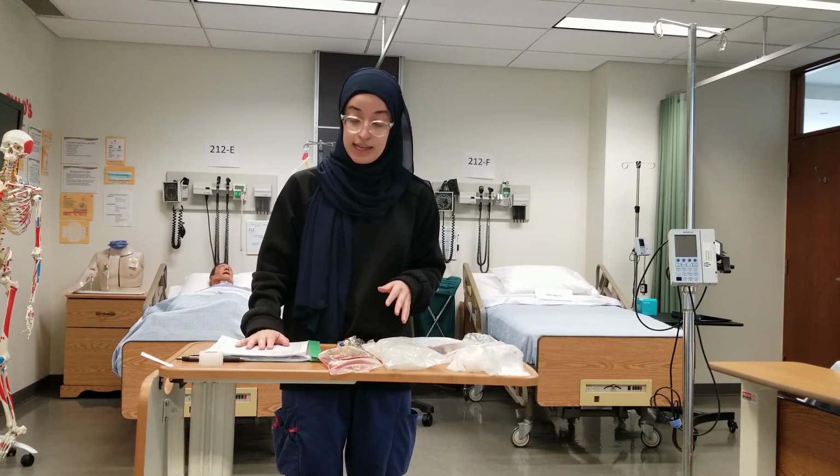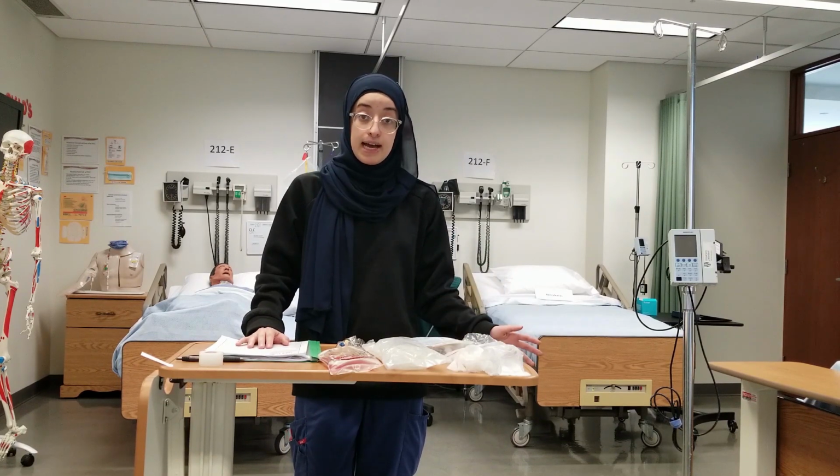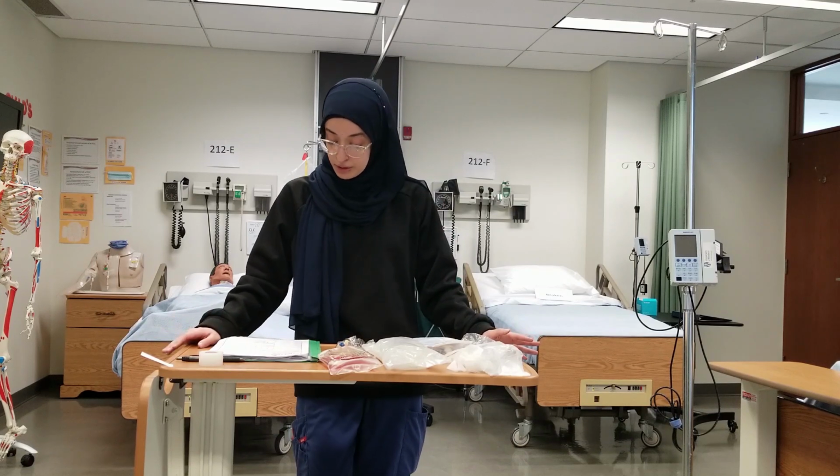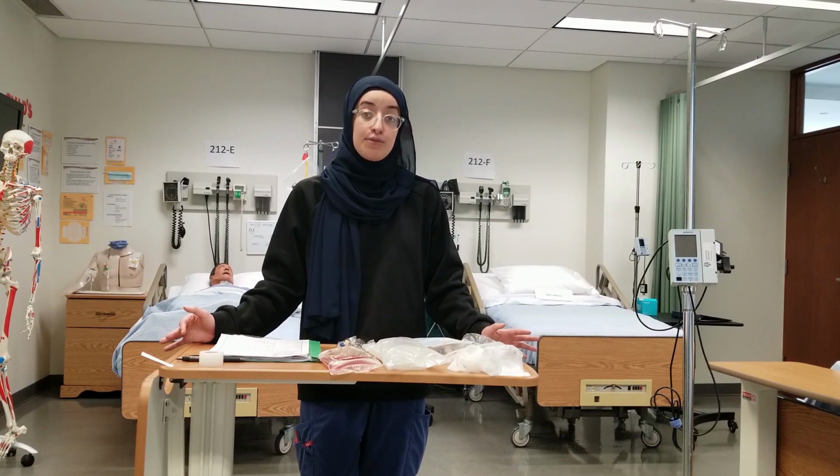We also want to take vitals at the start of our infusion, at a 15-minute mark, every hour, and then at the end and 4 hours post. So those are the baseline. Depending on the agency that you work at, that might differ.